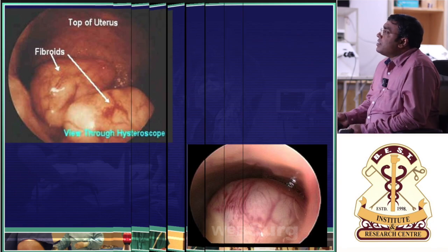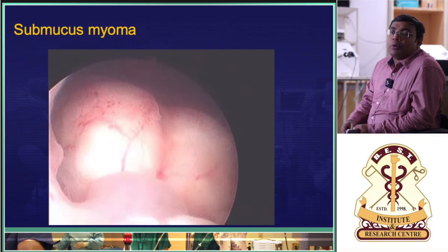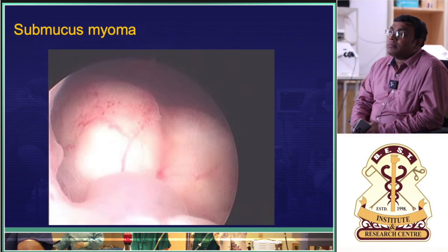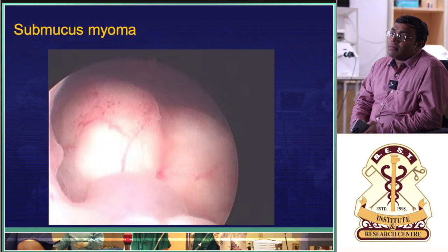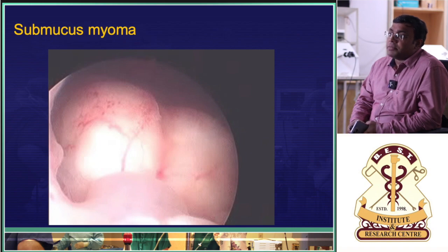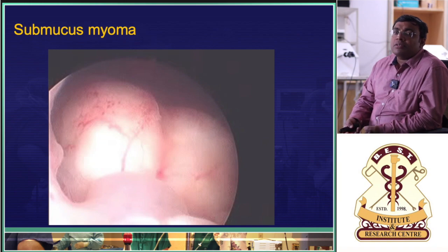So how do you differentiate between a myoma and a polyp? Purnima, hello. Polyp will be tongue-like shape. Huh? Tongue shape polyp. Always it should be a tongue shape. Mm. Fleshy. How do you know? You don't feel it, isn't it? Myoma also will have a pedicle.